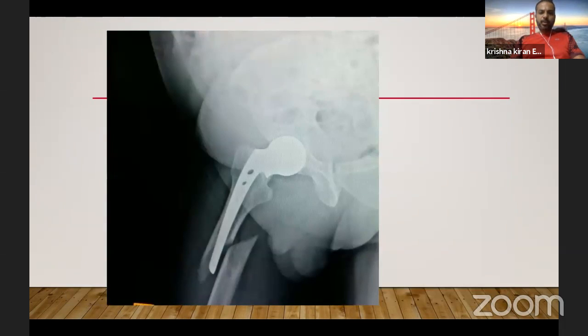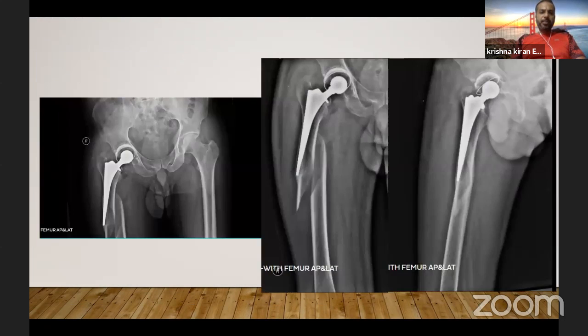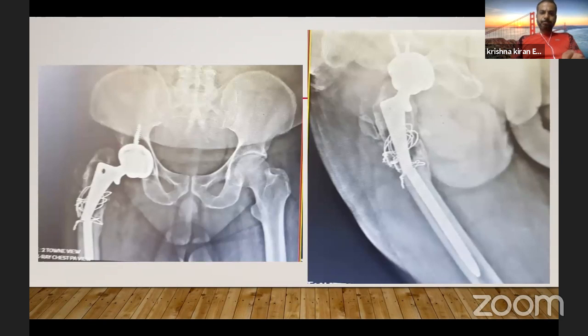So that is the principle. You can have situations where there is a periprosthetic fracture. Again, these will entail some levels of bone loss, and these are best managed either with a modular long stem, which will allow us proximal loading and bone reconstitution over a long period of time, or in certain situations where the proximal bone is damaged, you may have to do a Wagner type of device for these as well. But as you can see, these two are our go-to devices, the modular SROM with long stem or the monoblock Wagner type of device. These are our revision mainstays.